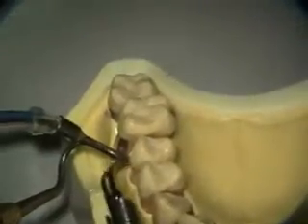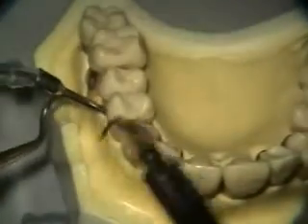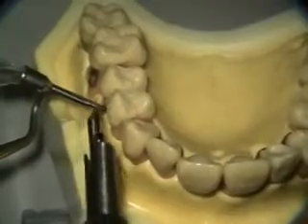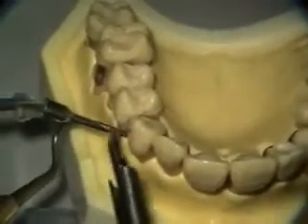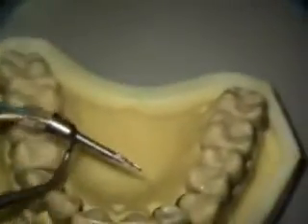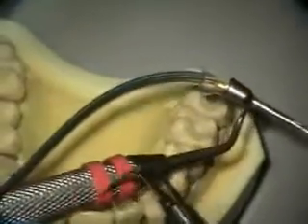Going into the distal here. A lot of times you don't need to cross instrument there because you can get quite a ways toward the palatal. Clean here, and then I'm done with this segment, so I'm going to change. I'm going to be going to the upper right now, and I'm going to change this back to the right.